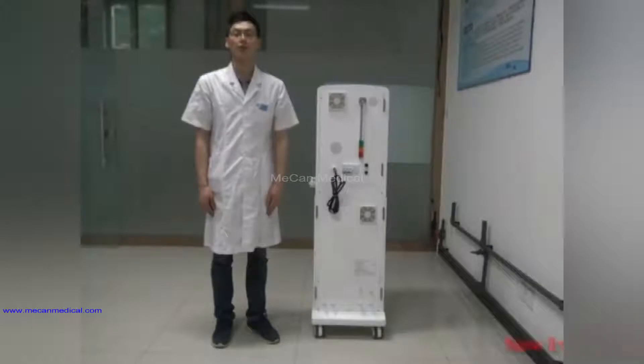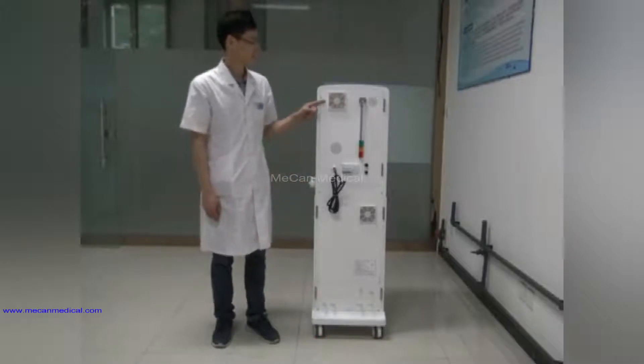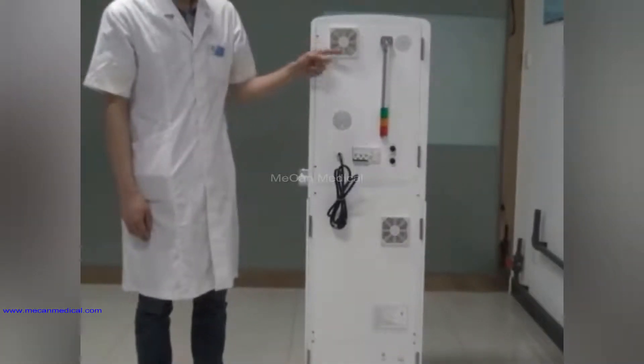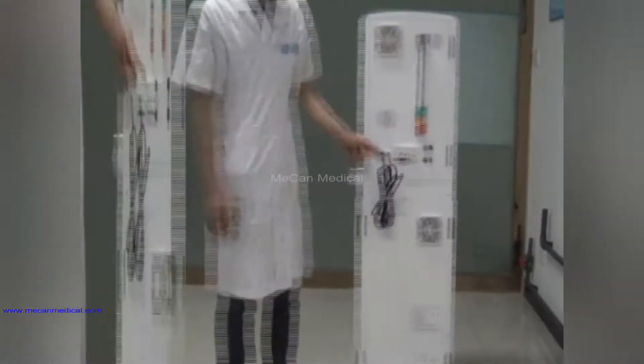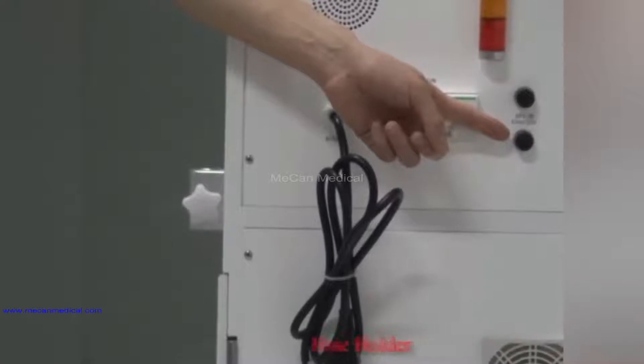Now I will introduce the back of the machine. At the back you can see the exhaust fan, the LED alarming light, the power line, power switch, and the fuse holder.